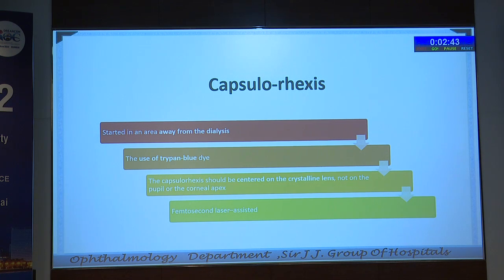The femtosecond laser, just now you have seen Mohan operating with femtosecond, is always better. But the people in India, they are not having femtosecond laser. In each city there may be 3, 4 big cities, metro. And other places, no femto. So we'll have to go with whatever we are doing by our hands.